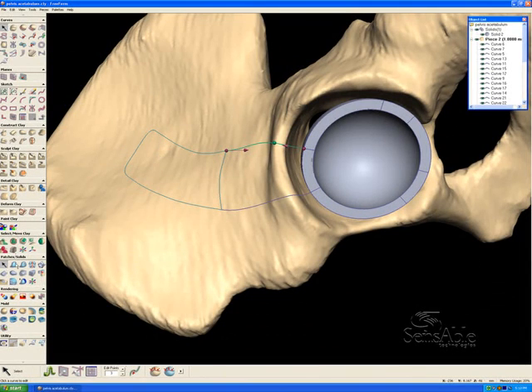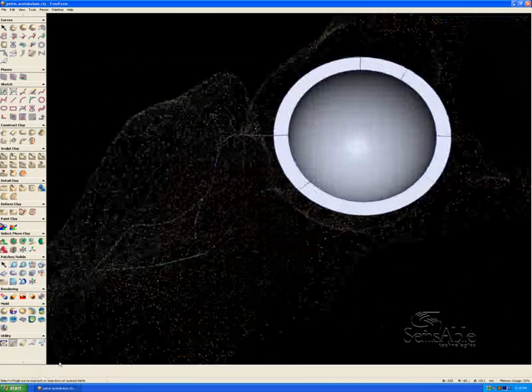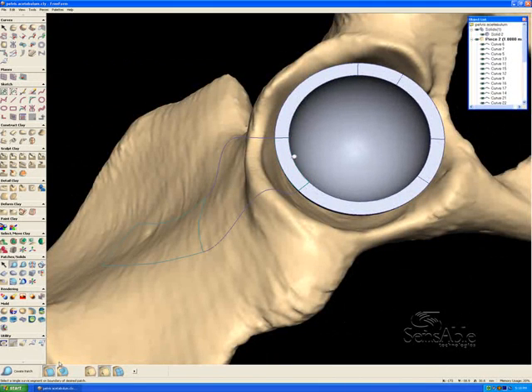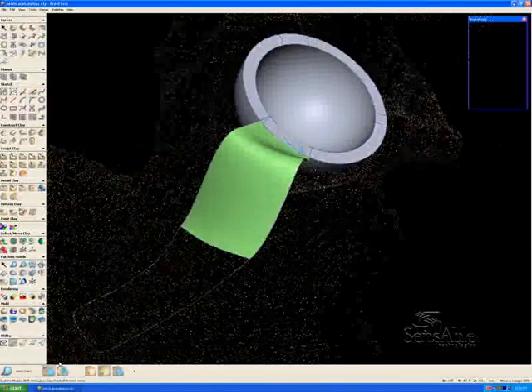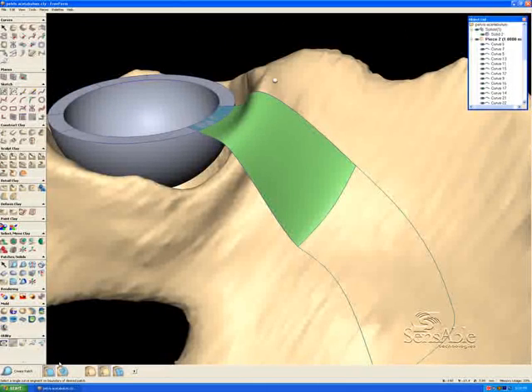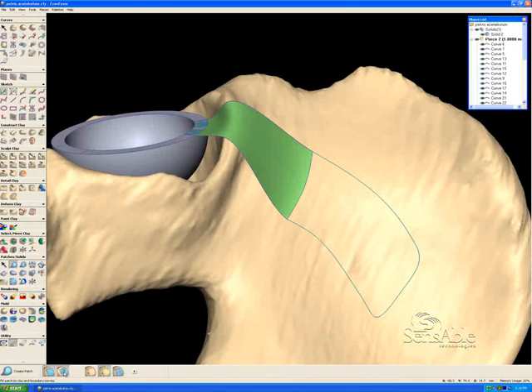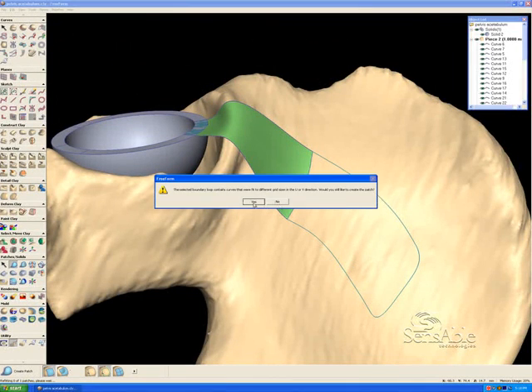So we're ready to go into the next function, which is I'm going to create some NURB surfaces based on these curve networks. The first surfaces that I'm going to create are not going to be fit to any clay. They're simply going to be representations of their boundaries. So you can see here that that surface that was created using those free-floating curves is not sucked down to the clay. Now for this surface here, I'm actually going to specify to fit to clay.